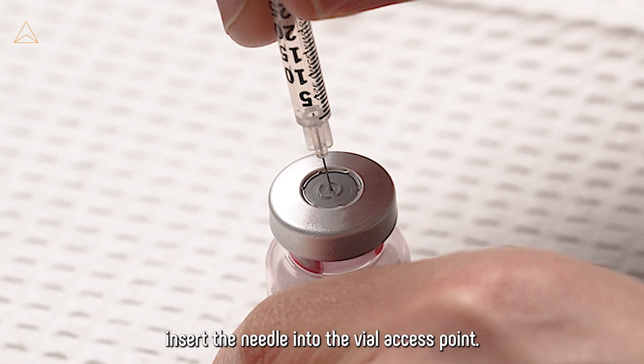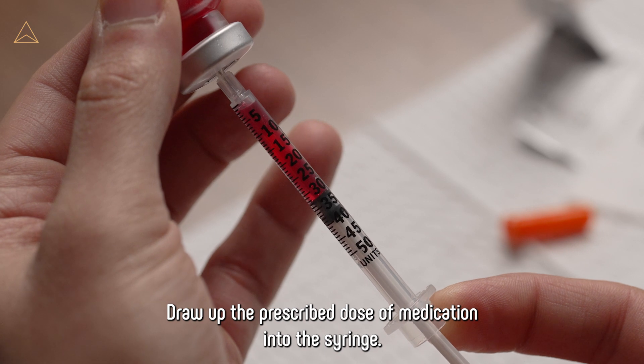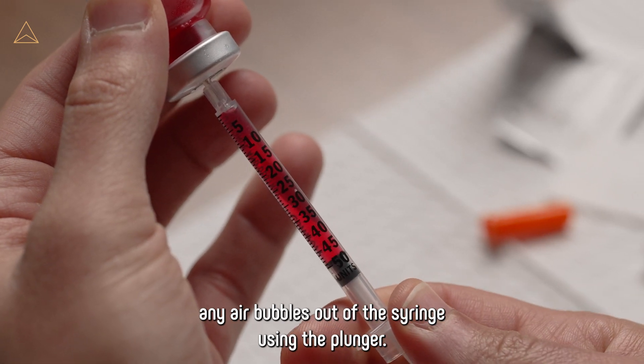Insert the needle into the vial access point. Draw up the prescribed dose of medication into the syringe. Once the medication is drawn into the syringe, carefully push any air bubbles out of the syringe using the plunger.